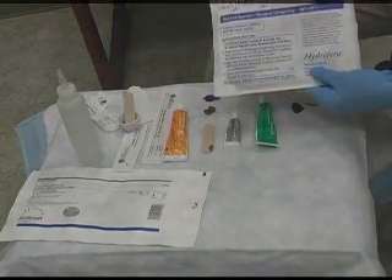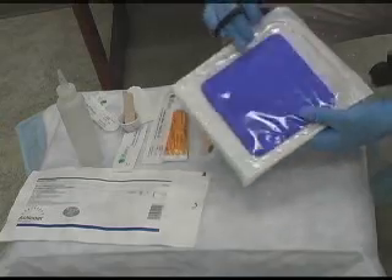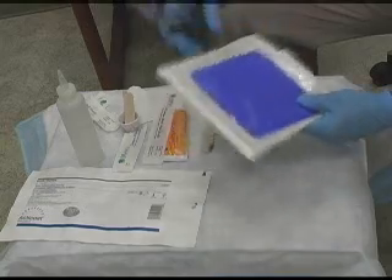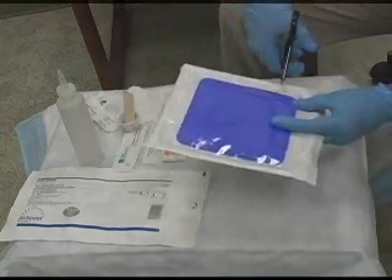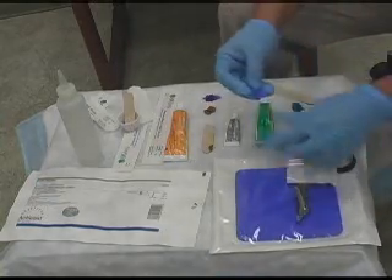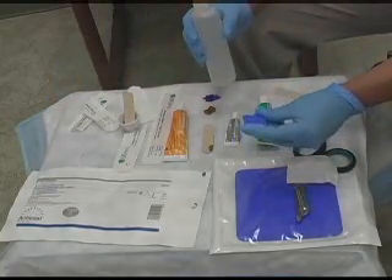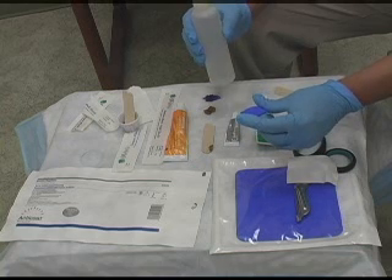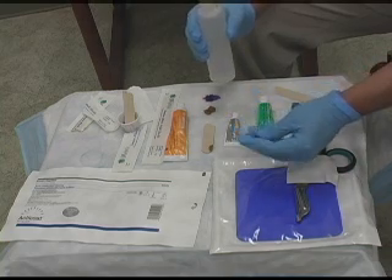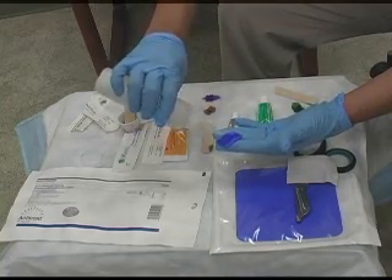This is another product called Hydroferra Blue. It's a bacteriostatic wound dressing. It contains methylene blue and crystal violet, which was used in the old days, and somebody decided to put them together into a sponge. If you notice, it's very hard. So what you need to do is cut the blue to fit directly into the wound bed. You don't want it to lap over onto any good tissue because it will macerate the bed. Once you get it cut to whatever wound size it is, you want to activate it or soak it down with normal saline.